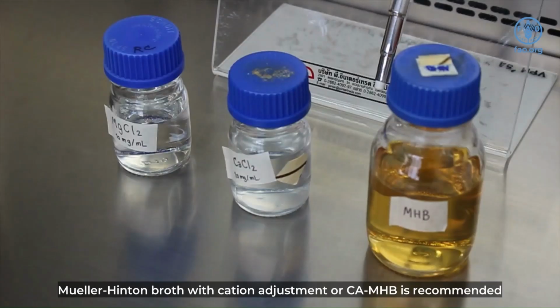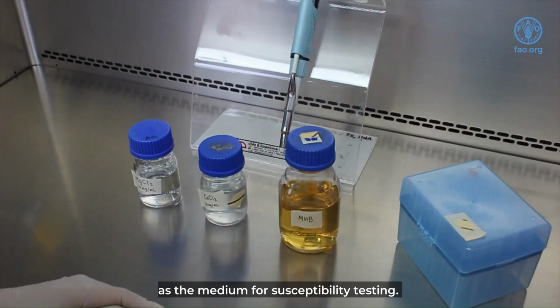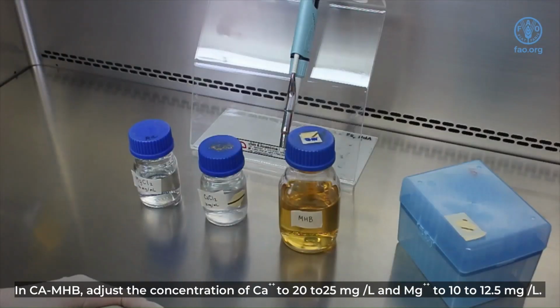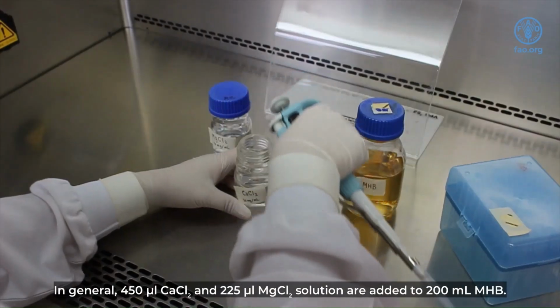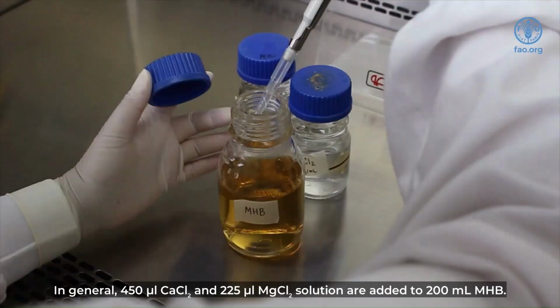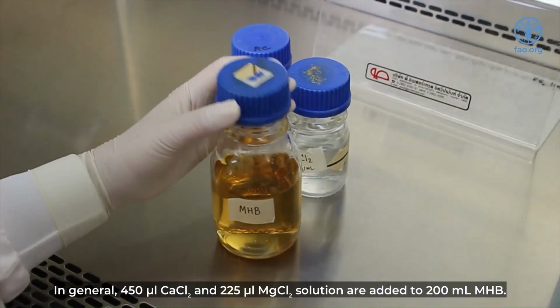Mueller-Hinton broth with cation adjustment, or CAMHB, is recommended as the medium for susceptibility testing. In CAMHB, adjust the concentration of calcium ion to 20 to 25 milligrams per liter and magnesium ion to 10 to 12.5 milligrams per liter. In general, 450 microliters calcium chloride and 225 microliters magnesium chloride solution are added to 200 milliliters MHB.